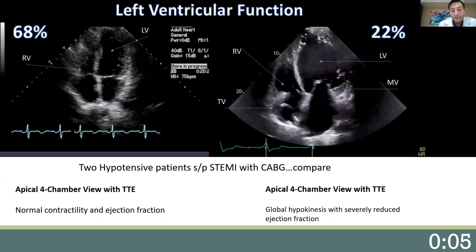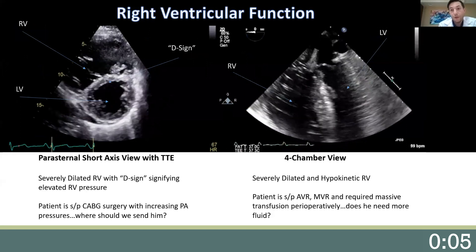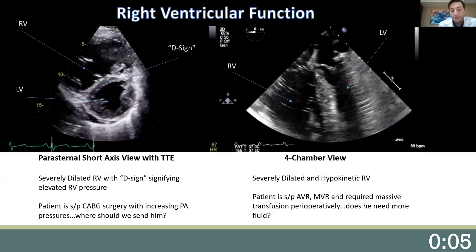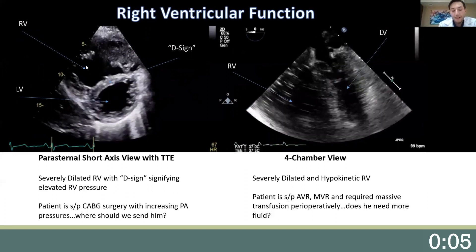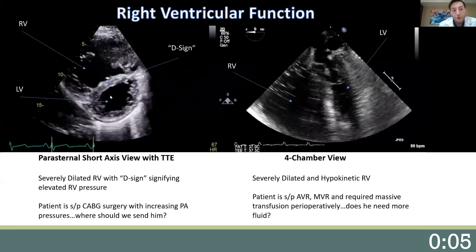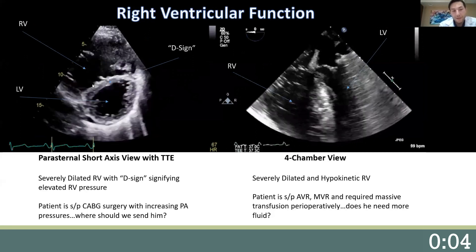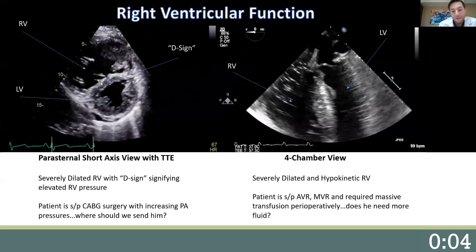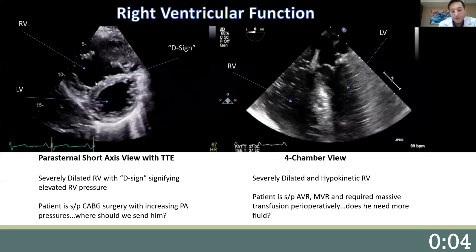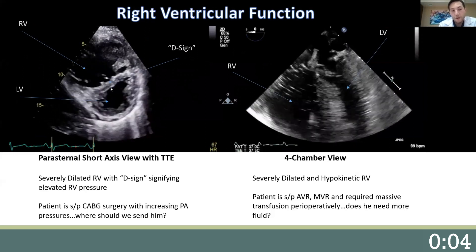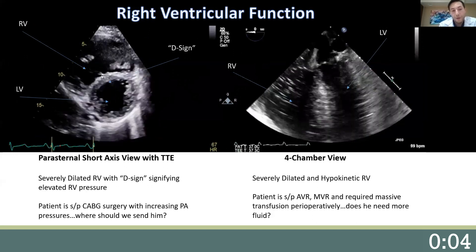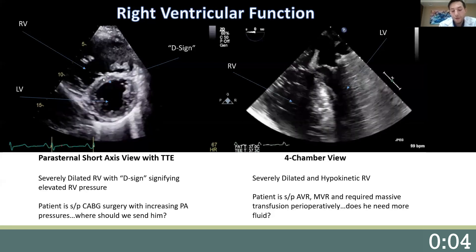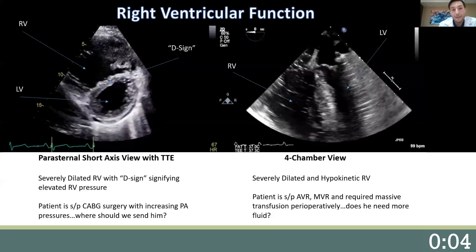A less discussed cause of hemodynamic instability is the right ventricle, which can be easily assessed by POCUS. Here on the left, we have a parasternal short axis view of the heart. We can clearly see a severely dilated RV anterior to a normal functioning LV. We can also see the D-sign, which is interventricular septal flattening during systole — a result of elevated RV pressures exceeding LV pressures. This can be caused by pulmonary hypertension or pulmonary embolism. In this patient, I would consider acutely decreasing pulmonary pressures and maybe sending for a STAT CT-PE.